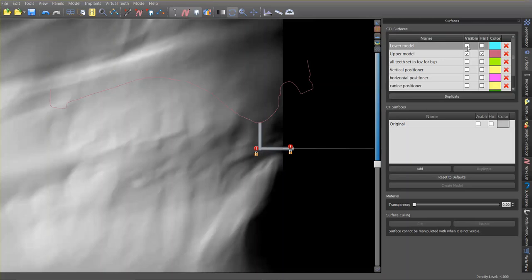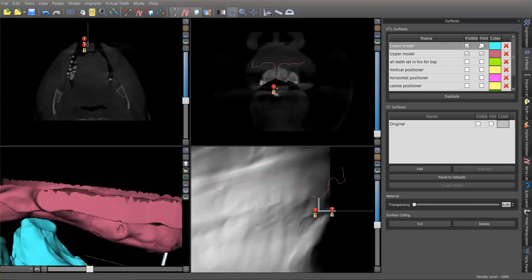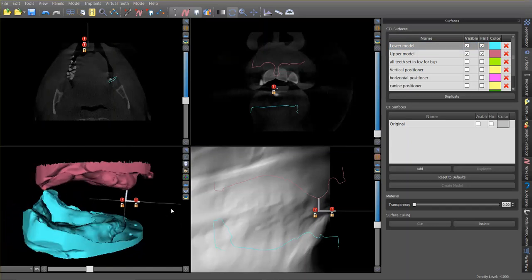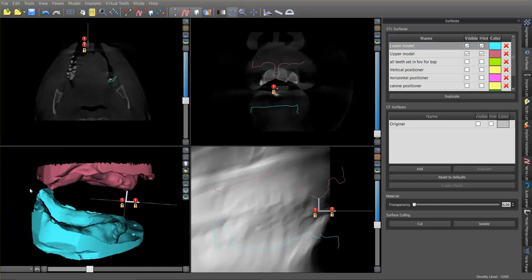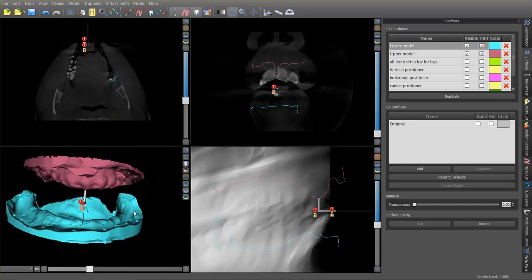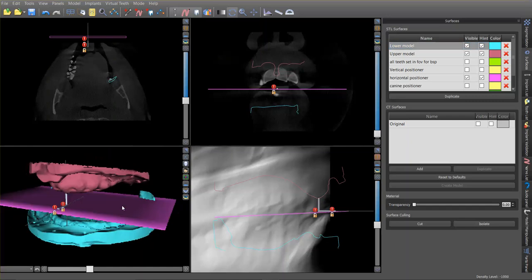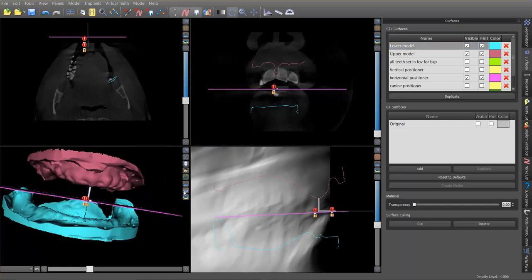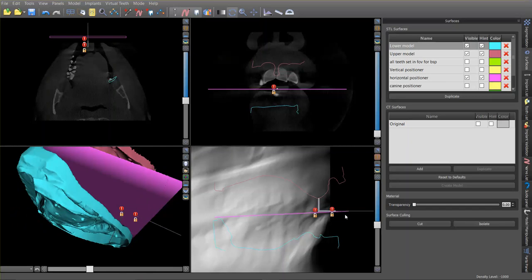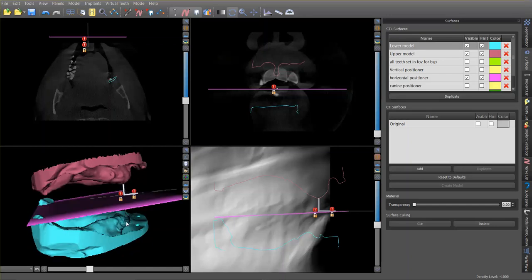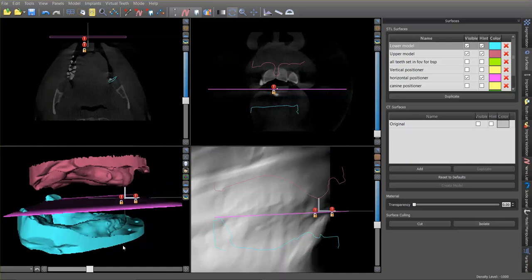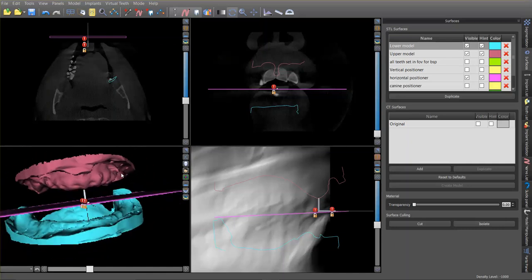The next question is where should the occlusal plane be. We have this cast — should it be going up this way, should it be going down this way? If you think back to your denture literature, you know the occlusal plane should go about two-thirds of the way up the retromolar pad. If we turn on a horizontal positioner, we can orient it so it passes through the point established for the incisal edge and then goes distally through two-thirds of the way up the retromolar pad. This gives us our occlusal plane.